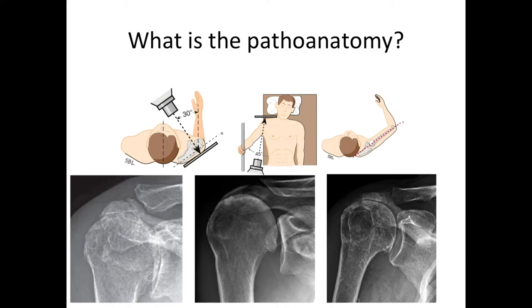It's important to look at the preoperative anatomy. Here are three cases of rotator cuff tear arthropathy, showing in each case abnormal contact between the humeral head and the acromion on top, and superior displacement of the humeral head relative to the socket. If any one of these patients had retained active elevation, we may be able to provide them with a good result with the CTA arthroplasty.